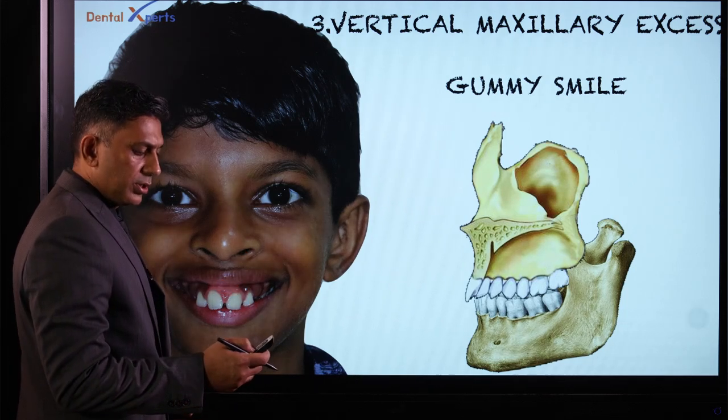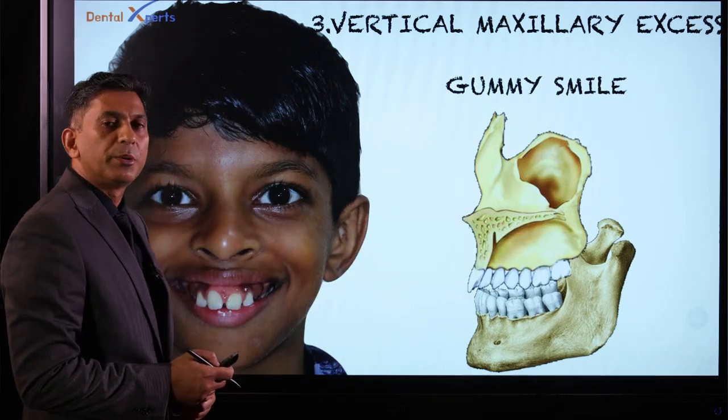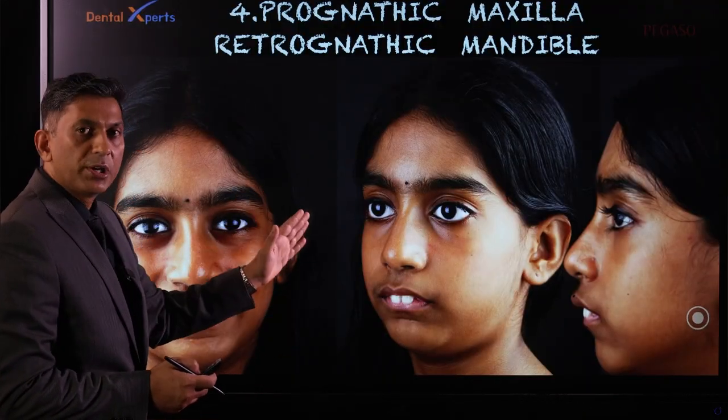So our target is to restrict and redirect the growth of maxilla with the help of orthopedic appliance, that is a headgear.